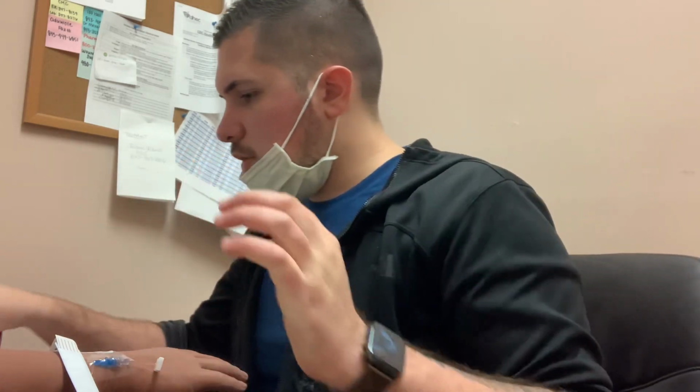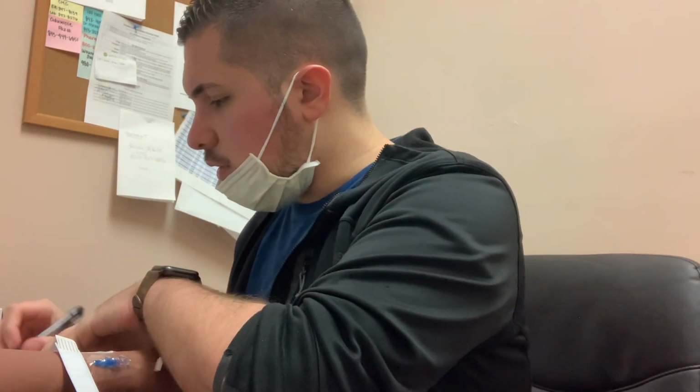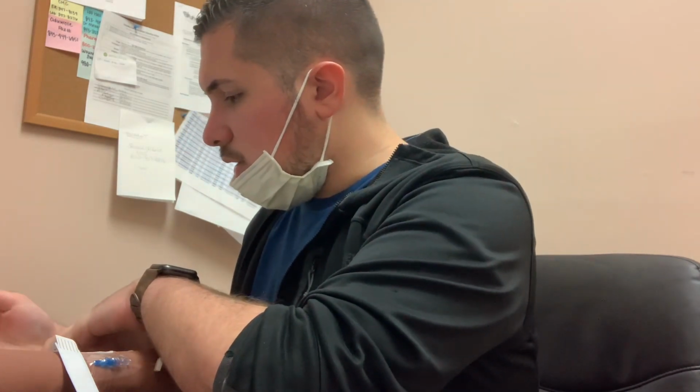Alright, we're going to check the order again, and it is 125 mLs per hour with a drop factor of 10.